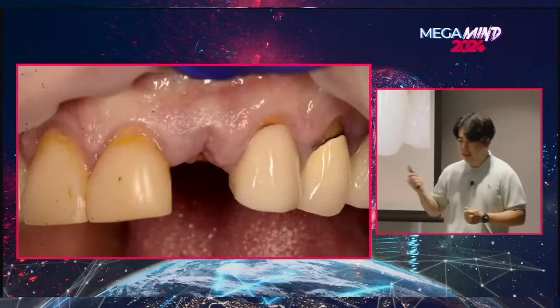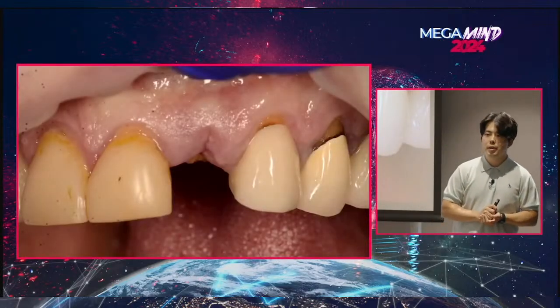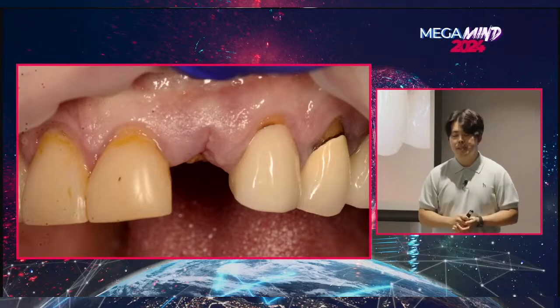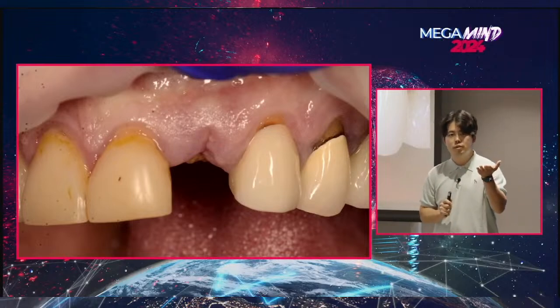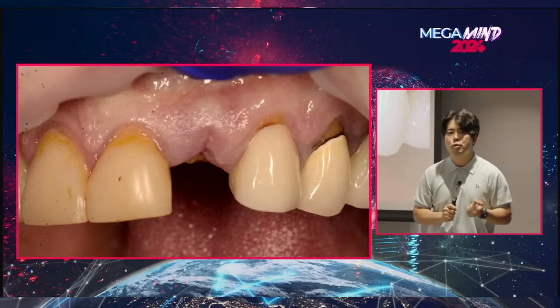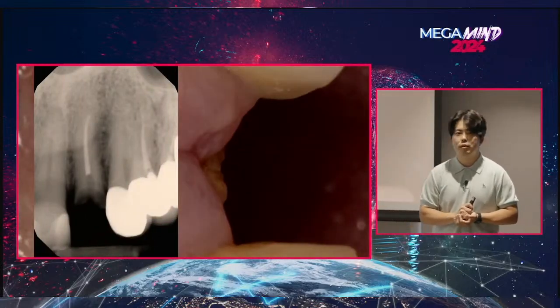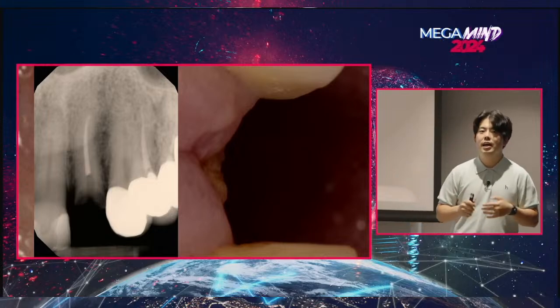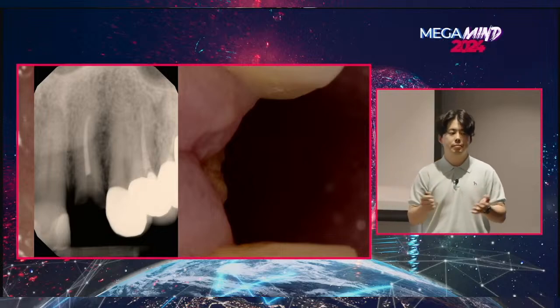So let's talk about the case of today. This is Dave, a 67-year-old male with many dental restorations in his mouth. Medically, he's a little bit hypertensive, otherwise pretty healthy. And one day he visits me with a tooth in his hand. His lateral incisor post-core crown complex has broken out of his mouth. And as you would imagine, there really isn't much for us to save. He wanted his tooth back, so naturally, we began to talk about implant therapy as an option, and the patient accepts.